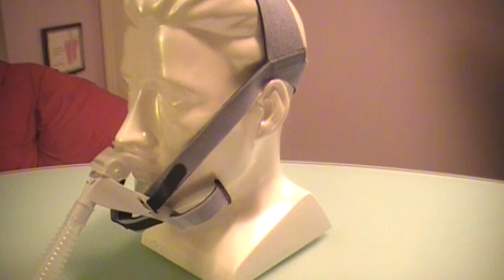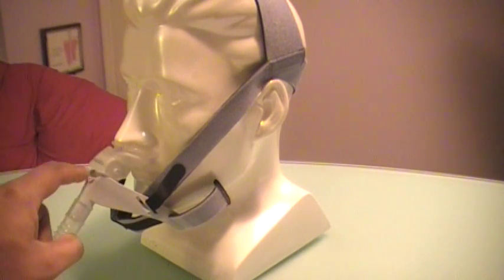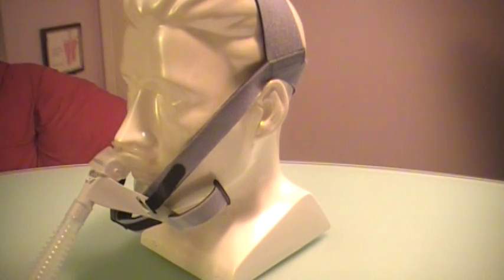What's odd enough is the group of people that has had the best success on this that I've seen is those with really high CPAP pressures. I have patients who are at 18 and 20 centimeters water, and they love it. The biggest problem they have is it's a little noisy, because there's so much pressure coming out of the exhalation port that it creates a lot of noise.